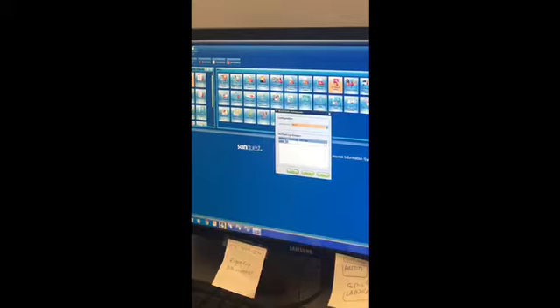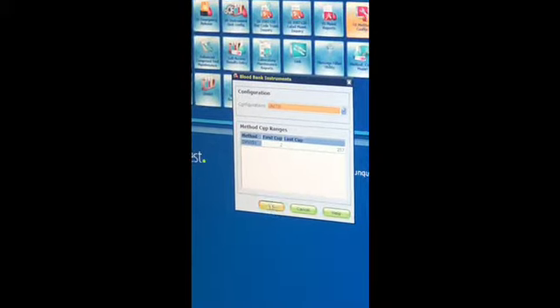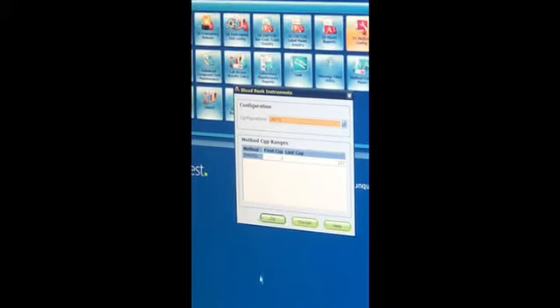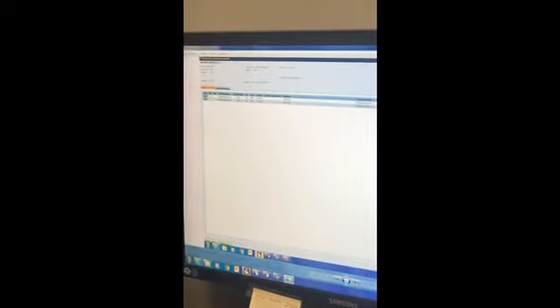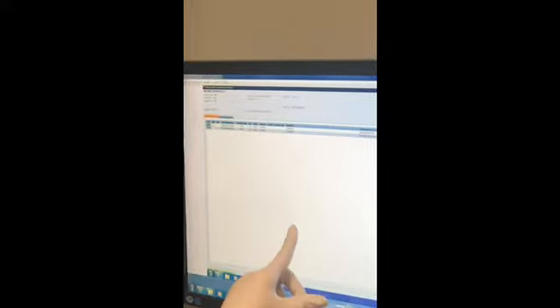and you would see the cups in this area right here, and then you will click on OK, and when you click on OK, your units is going to pop up. Okay. Once you click on BB Instruments, you select units, you click OK, this screen right here is going to pop up. And you're going to just verify all your units are there. All right. Once you verify your units are there, you're going to click the release button for each one of them over here in the corner.